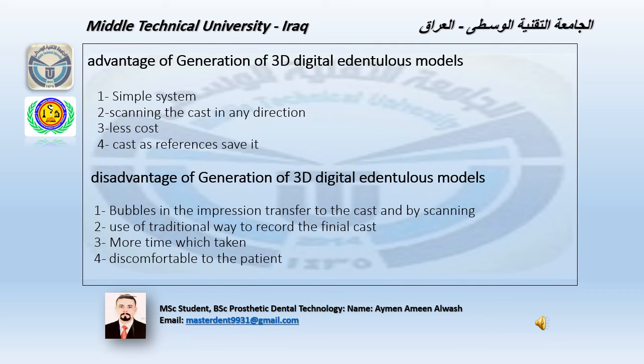Advantages of generation of a 3D digital edentulous model. Number 1, simple system. Number 2, scanning the cast in any direction. Number 3, less cost. Number 4, the cast is saved as a reference.